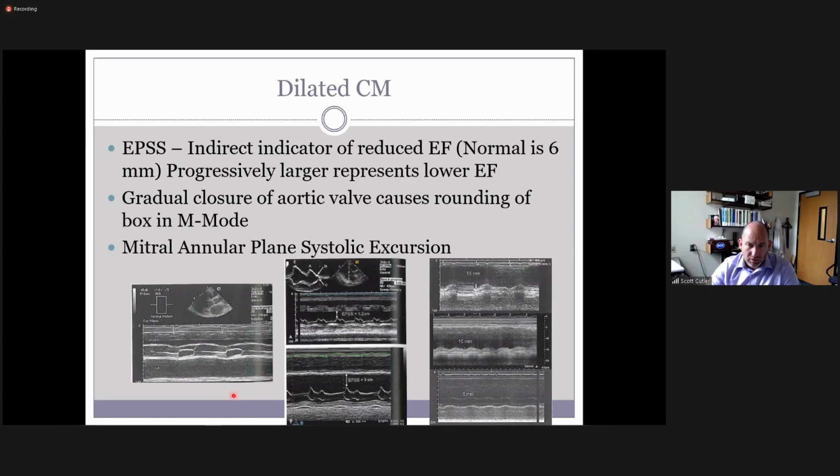You will learn in echo that sometimes you don't see what's going on, but you have a gut feeling that something's there, okay? I would say as an experienced tech that you need to trust your gut sometimes. And sometimes you're still not going to find the evidence you're looking for, but if you feel like something's probably not right, you need to go looking for what's wrong. You need to pay attention closely to the numbers, pay attention to what's happening, because often your gut's going to lead you in the right direction.